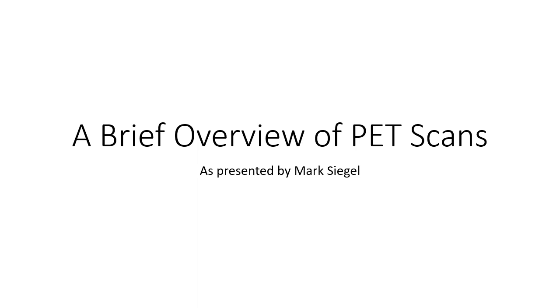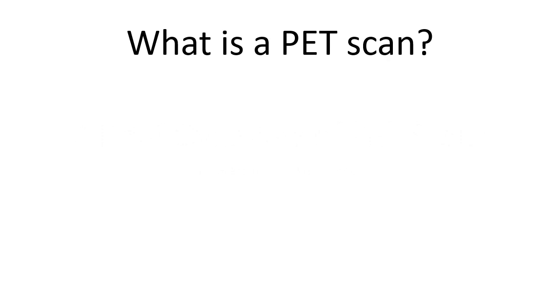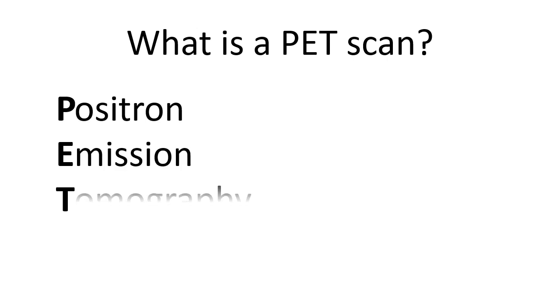Welcome to a brief overview of PET scans. So what is a PET scan? Many people have undergone PET scans and have heard of them, but very few people actually know what's going on behind the scenes. So starting with the acronym PET, PET stands for Positron Emission Tomography.